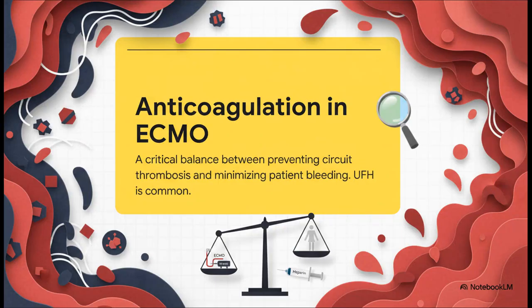Now, one of our most challenging minute-to-minute tasks is managing anticoagulation, and this is a true balancing act, a constant tightrope walk. On one hand, the foreign surface of the extracorporeal circuit is intensely thrombogenic, and we have to prevent clots. On the other hand, these patients are critically ill and incredibly prone to bleeding. Unfractionated heparin remains the workhorse here, mostly because it's cheap, has a short half-life, and we can reverse it. But it definitely comes with its own set of challenges.